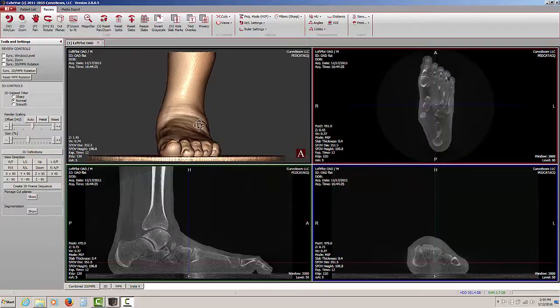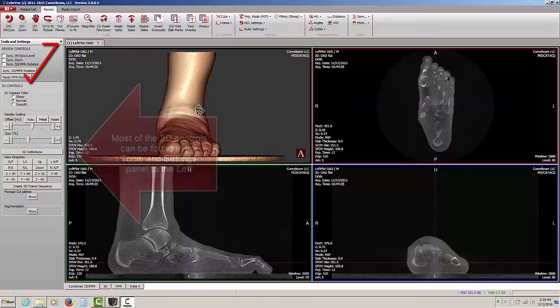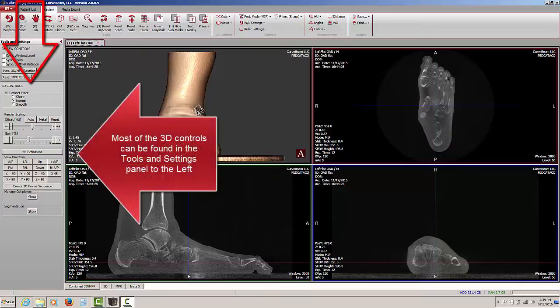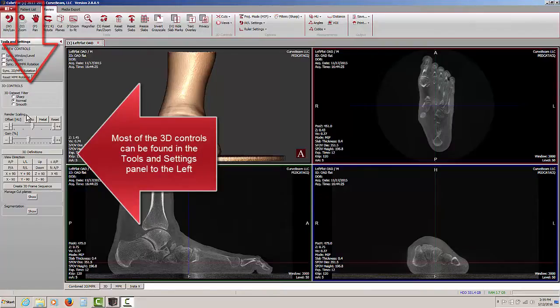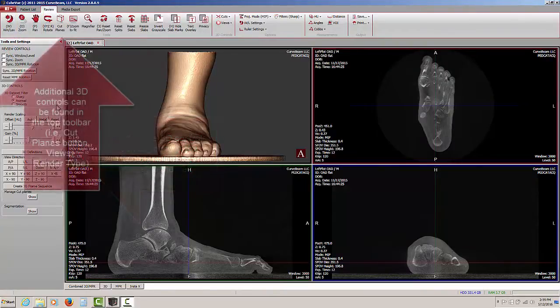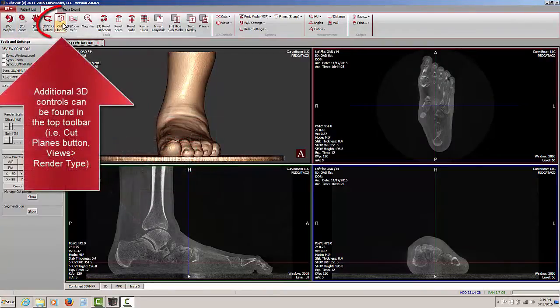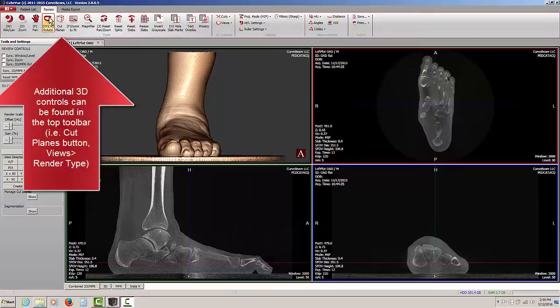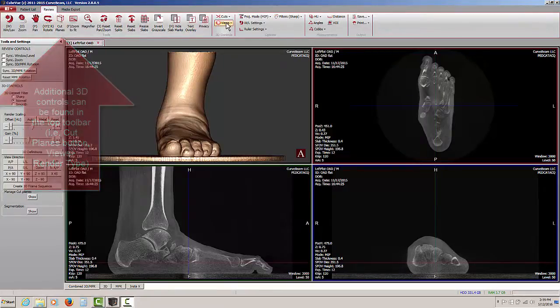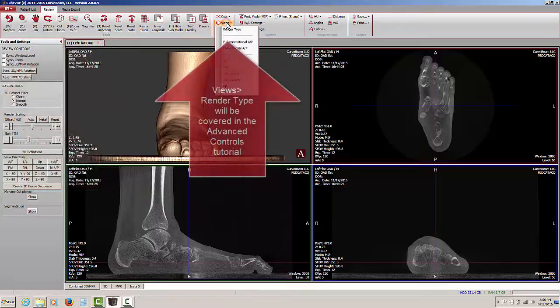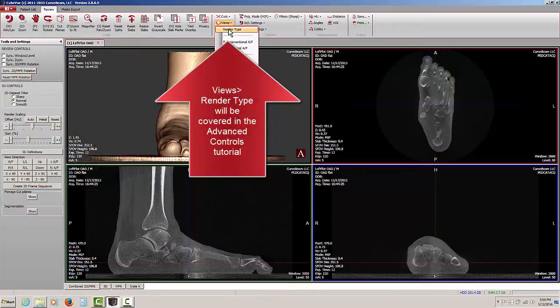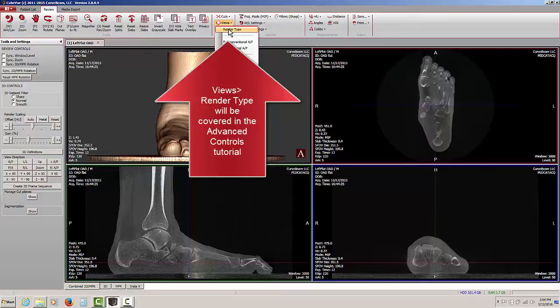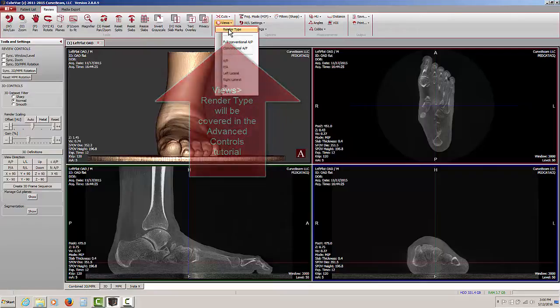Most of the controls for the 3D rendering are found here in the Tools and Settings panel to the left. There are also some additional controls in the top toolbar, for example to activate the cut plane or to rotate the 3D data set restricting motion to one plane. Under the views there are several different render types which will change the appearance of the 3D rendering.